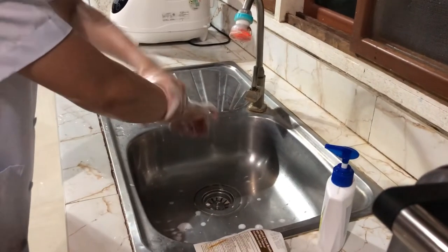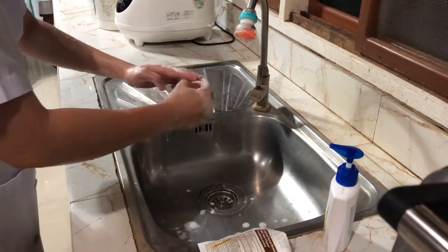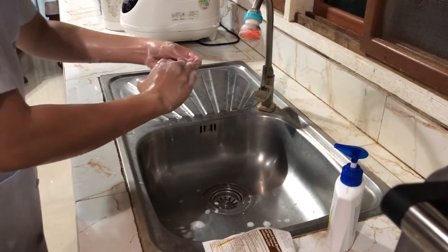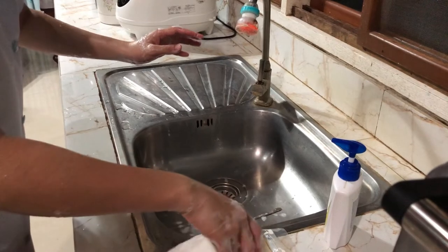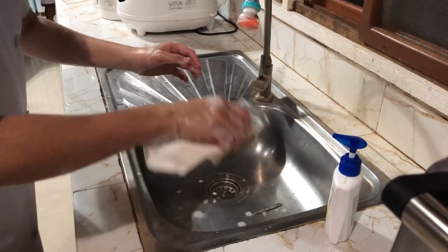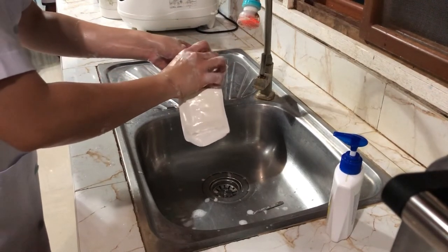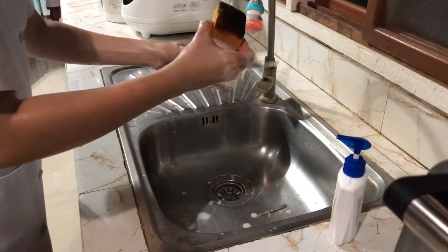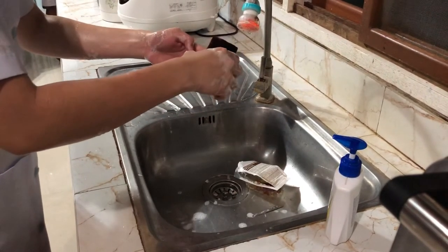When using a prepackaged scrub brush sponge pad, open the package, remove the nail cleaner, clean the nails, and discard. Then remove the brush and discard the wrapper. Do not set down the brush once the scrub is begun. If the brush or sponge is not impregnated with the cleaning agent, moisten the brush or pad and dispense the soap onto it. Once the scrub is begun, the brush is never put down until the scrub is complete, as it would then be contaminated.